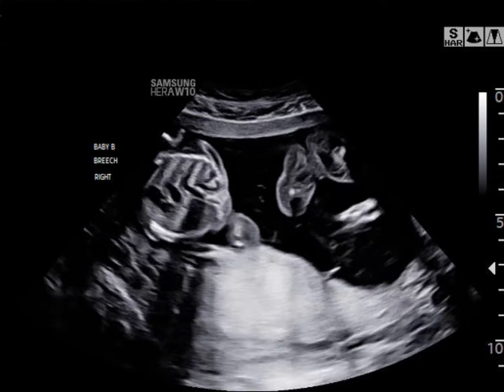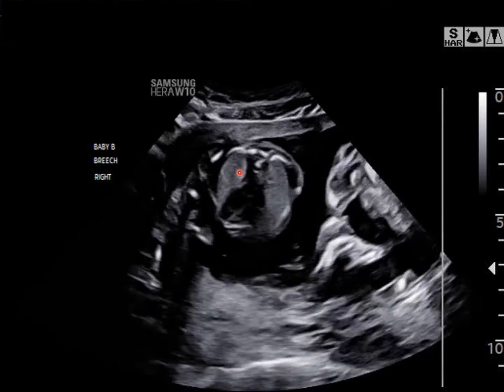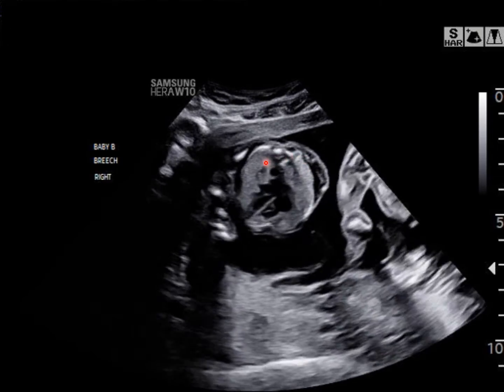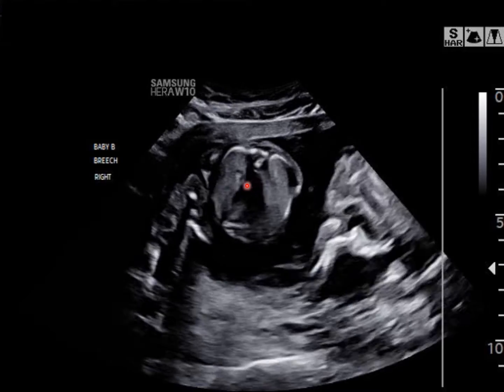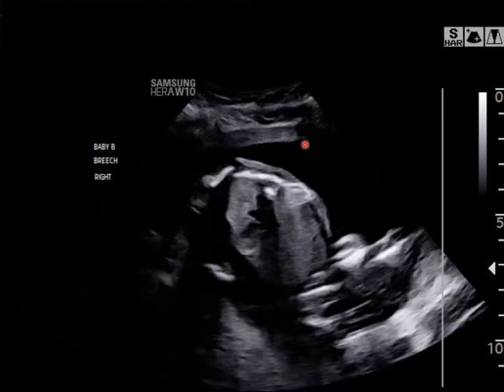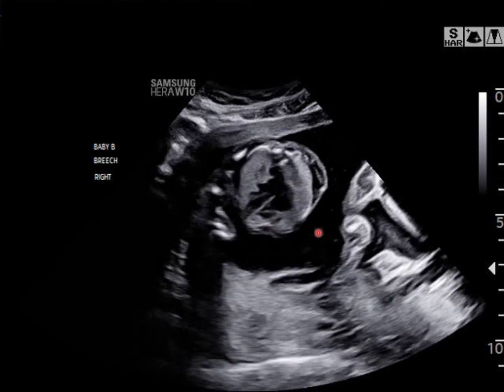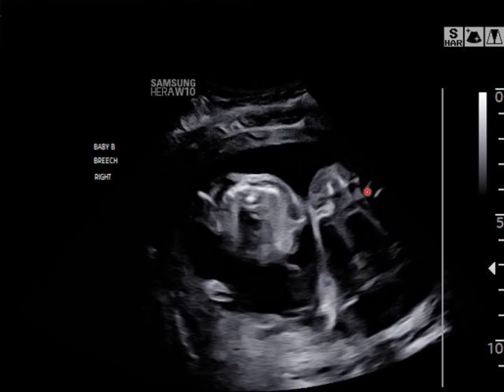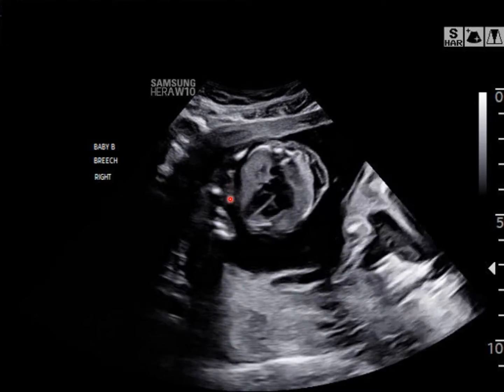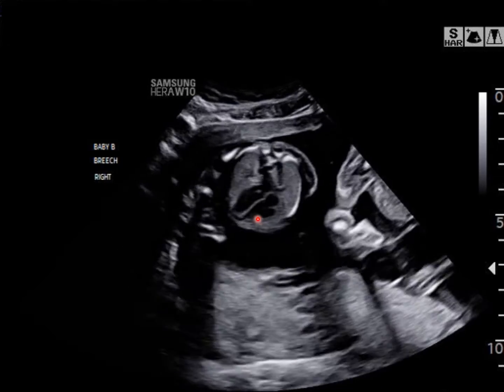And that would allow me to then focus more on twin B in those transverse thoracic 4-chamber upper chest views. Then I would zoom in on this fetus and create a really good tight image. And of course, twin A is very active, as they usually are, so you would need to avoid losing track of that by occasionally panning out and reestablishing where you are.